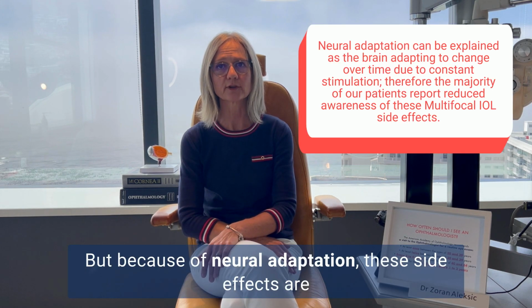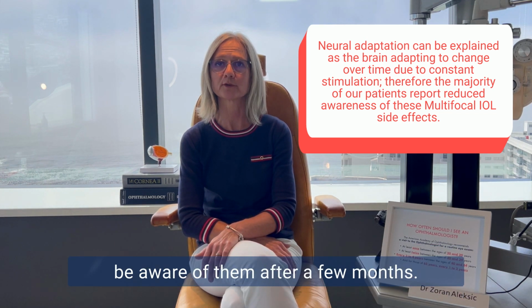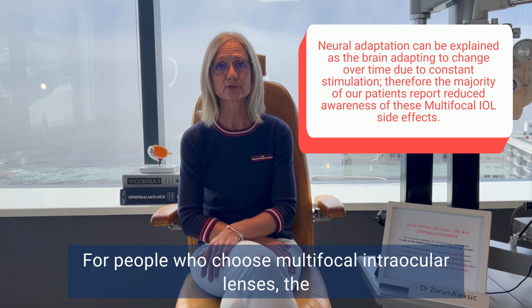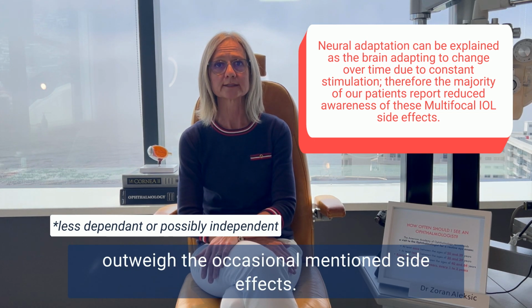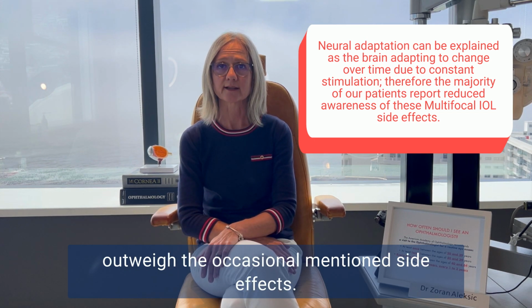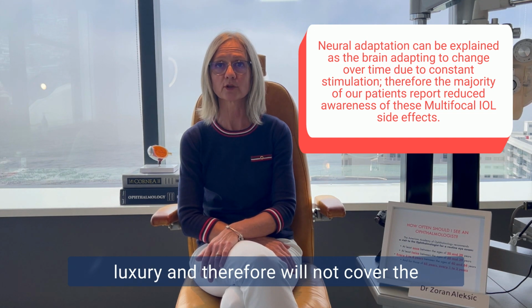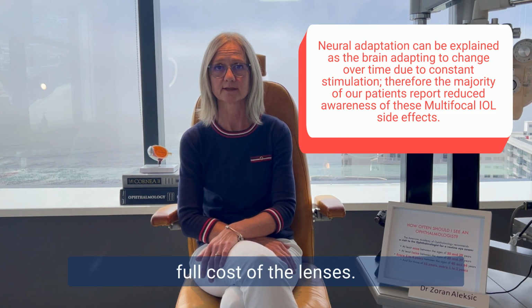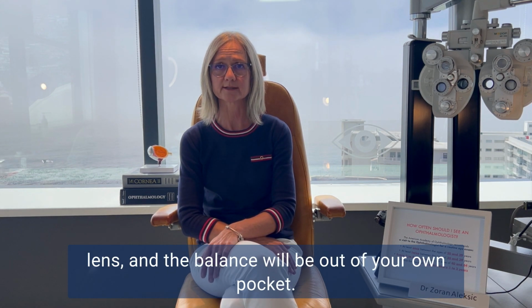But because of neural adaptation, these side effects are usually temporary, and the majority of people will not be aware of them after a few months. For people who choose multifocal intraocular lenses, the advantage of being independent of reading glasses far outweighs the occasional mentioned side effects. Medical aids consider multifocal lens implants a luxury and therefore will not cover the full cost of the lenses. They will only pay as much as they would for a monofocal lens, and the balance will be out of your own pocket.